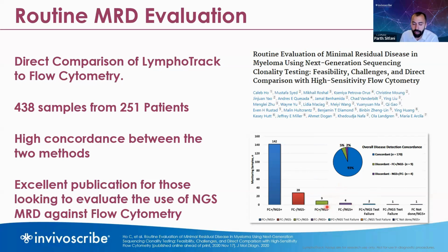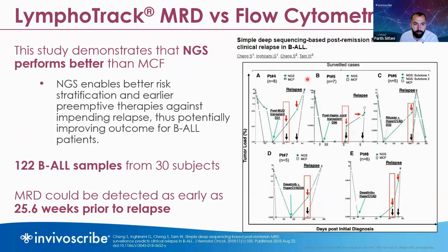But at the end of the day, we want to see something done like this, where for those 13, were there cases and time points where one or the other technology was negative or one was positive? And to be honest, I think the most likely result is that you should use both of them together. That will be the likely conclusion, use both technologies, at least until there's one clear advantage. But right now, I think in the next 5 years, we will see concurrent use of the two platforms.